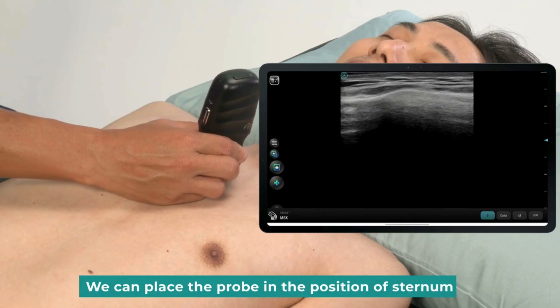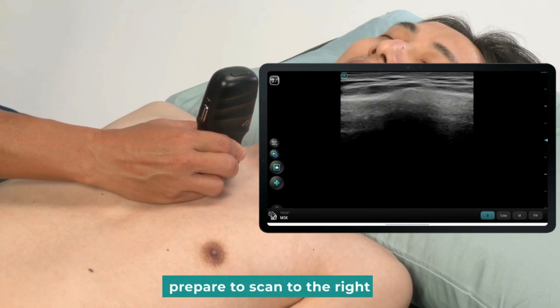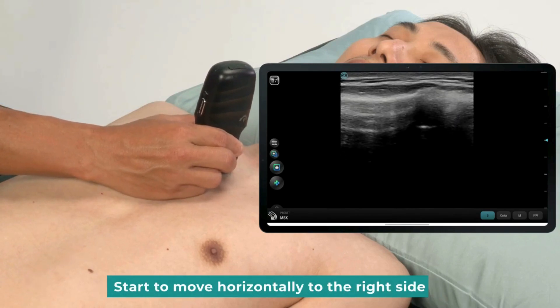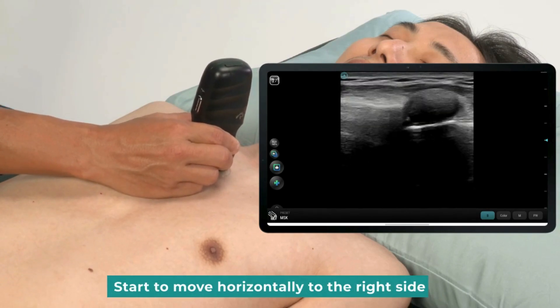We can place the probe in the position of the sternum. Prepare to scan to the right. Observe slowly for when the cartilage appears. Start to move horizontally to the right side.